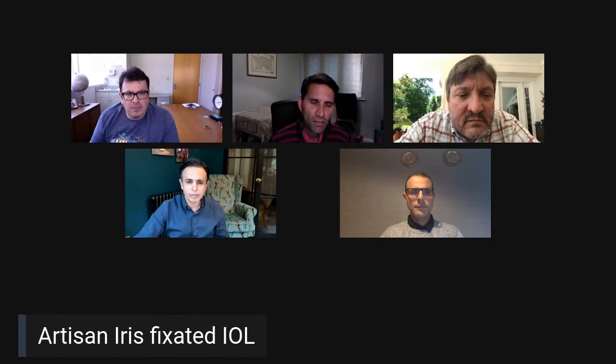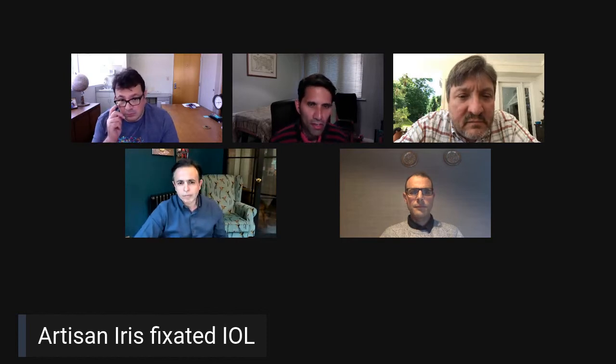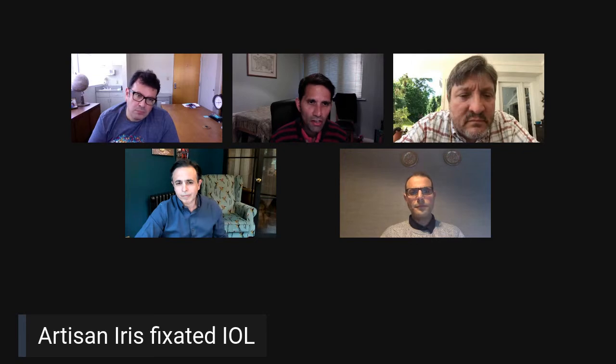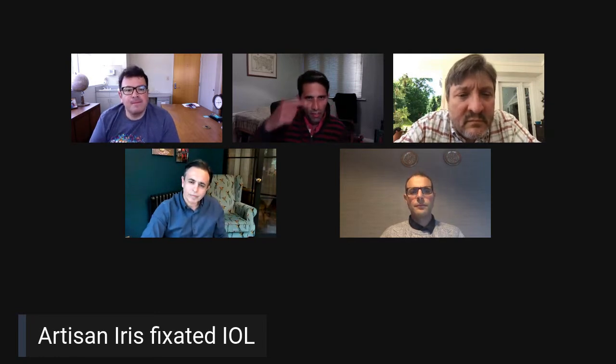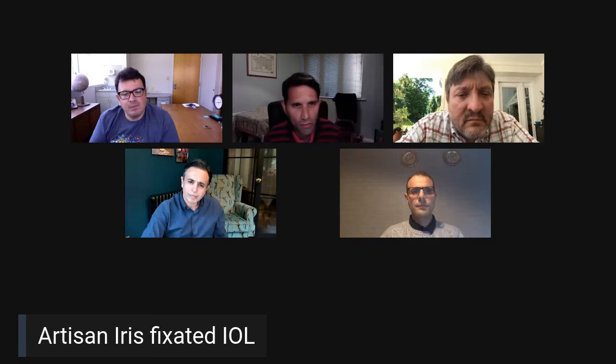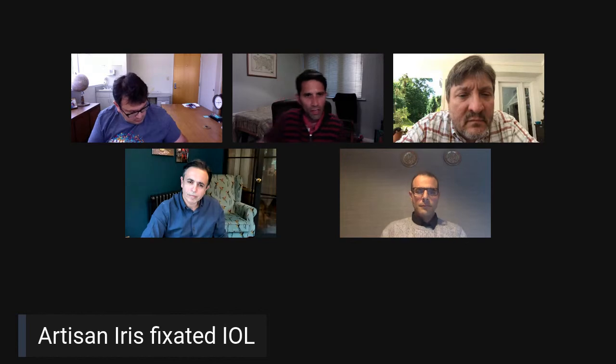My experience of these lenses, and I'd like to hear what you think, is that putting it behind the iris, perversely, is easier than putting them on the front. Intuitively you might be more anxious, but I think it's easier to put it behind and push up, and then you get the imprint, which is very nice, to then pop the iris through the haptic. Whereas pushing down, you tend to be pushing the iris away, and then you have to suck with the Vacufix. Do you feel the same? I mean, you presumably don't do them at the front anymore.